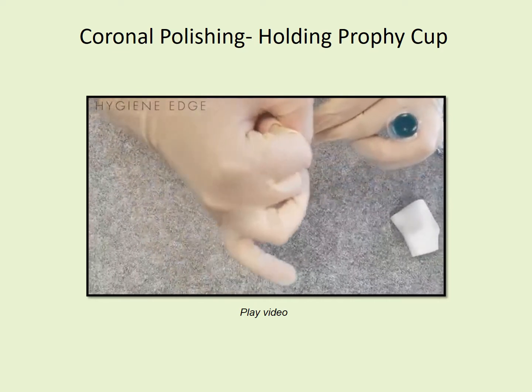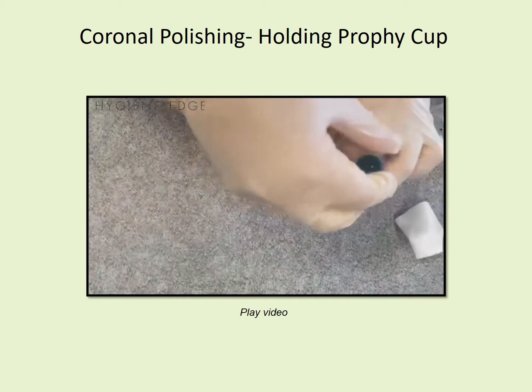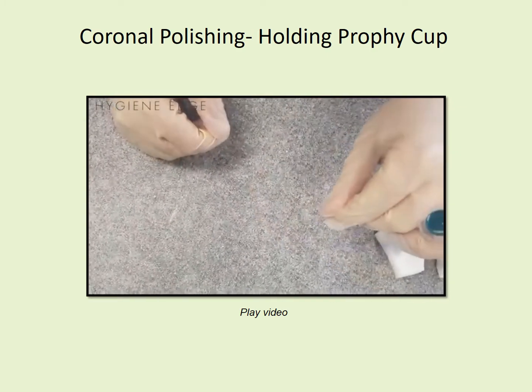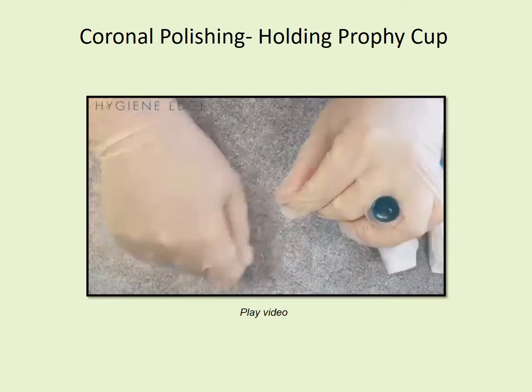Another way you can hold it is on this top side. You make a little hook with your ring finger. You can hold it in there. So you're holding your mirror through traction and you grab it like that.